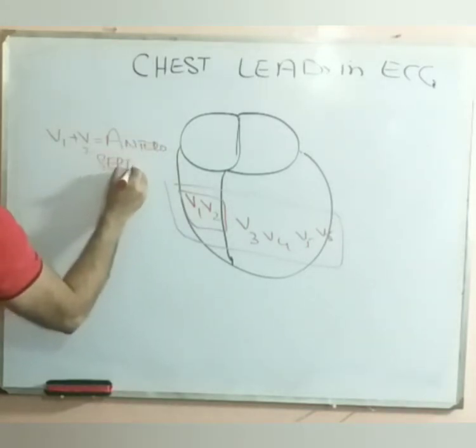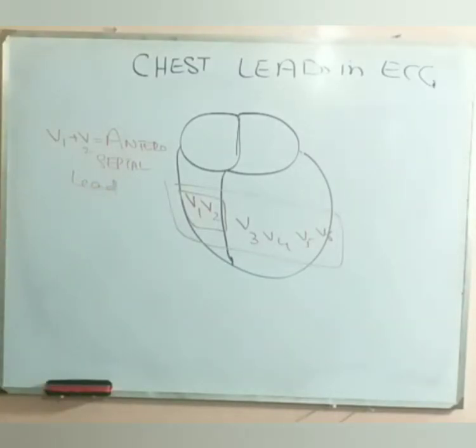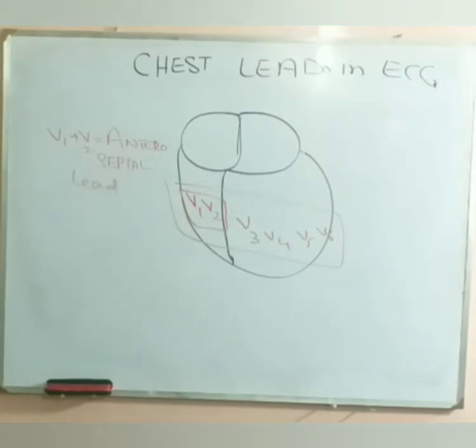They look at the part of the anterior wall located towards the septal side.